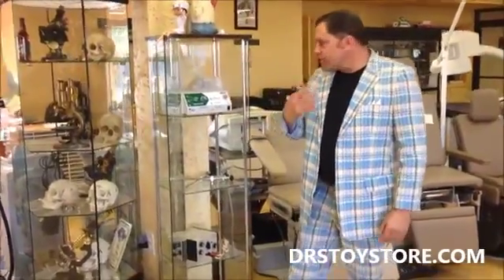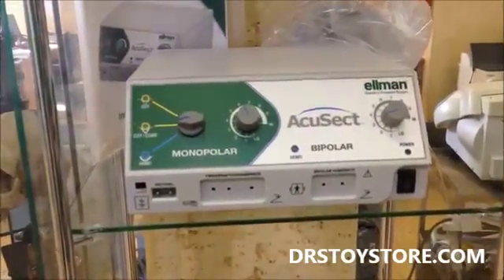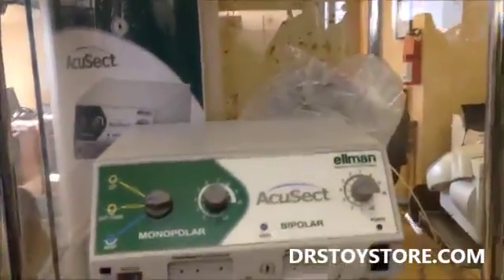Want to come in here, folks, a little closer? These are refurbished AccuSets. Brand new, they're typically $6,000–$7,000. They come complete with the Elman book, the foot pedal, and the hand pieces.